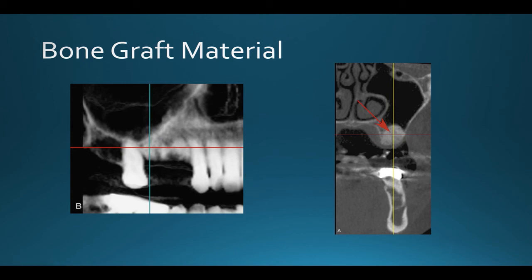Again, I don't anticipate most people seeing this, but it is good to know if a patient is having implant treatment, you might be able to see a bone graft, and this is using cone beam computed technology, because you wouldn't necessarily see a bone graft on any other type of radiograph. They are growing in popularity as more people are getting implants, so it is good to know that if someone is getting an implant and they don't have enough bone in the area, they need to make sure that they get a bone graft, and if they are to get one, they might be sent out for a cone beam radiograph, which is something we'll go over later in class.